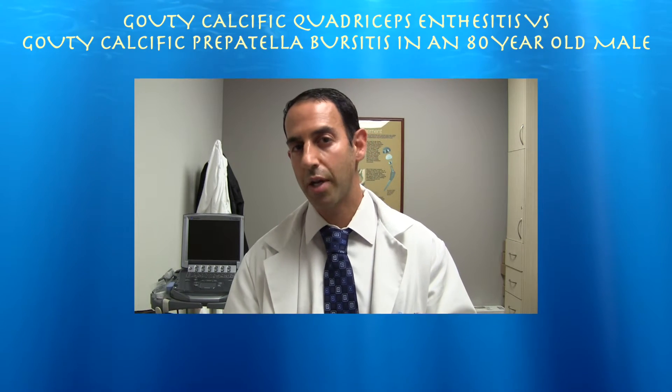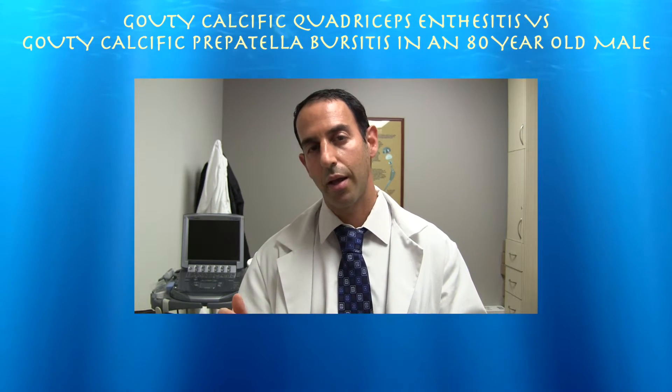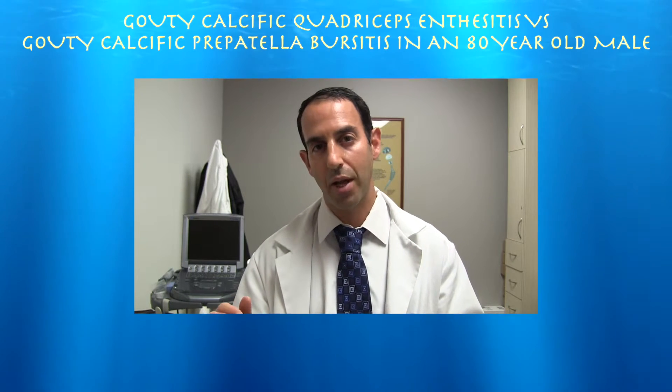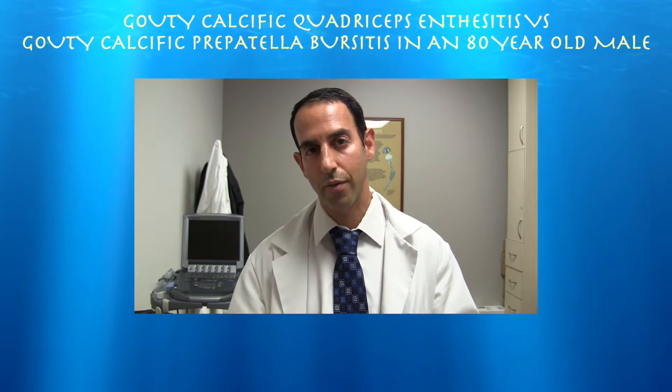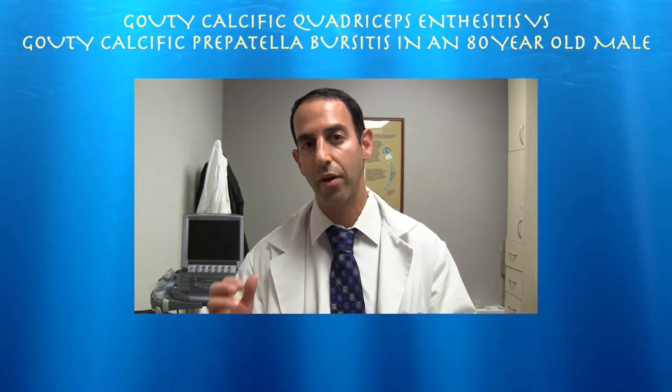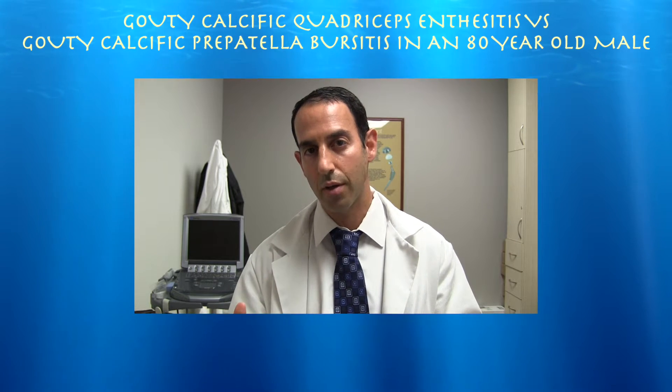Here's a very interesting case of a man who had just a couple of days of extreme pain in his knee with no injury. On physical exam he had a lot of tenderness at the insertion of the quad tendon. Ultrasound demonstrated some calcification of the distal quad tendon, and I believe he was suffering from a gouty enthesitis of the quad tendon.